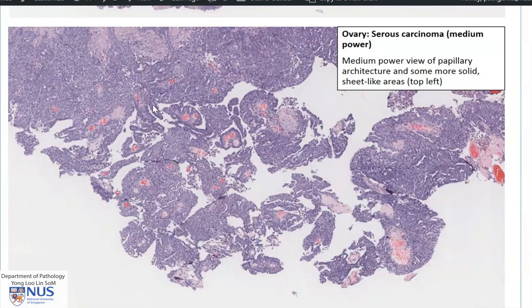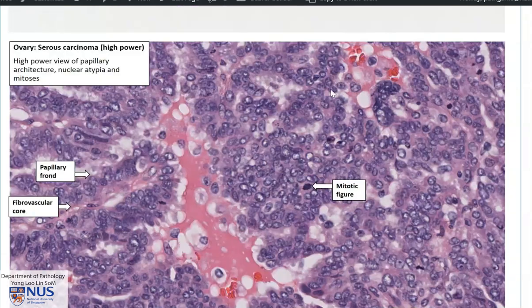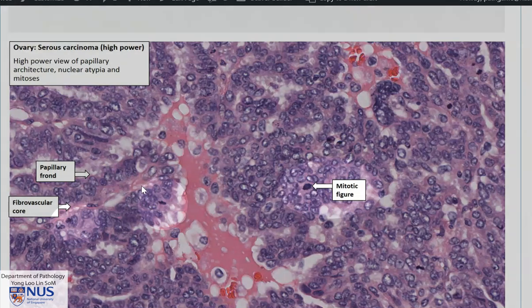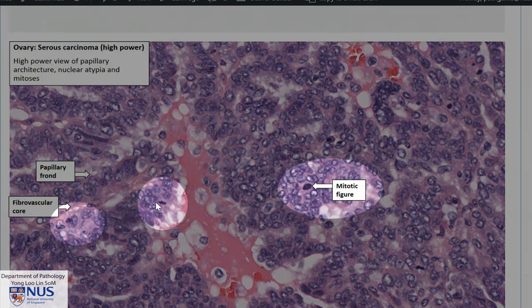At higher magnification, we can see slender but rather complex papillary structures. It is very blue because it is very cellular, and there are large sheets of malignant cells. At even higher magnification, we can see malignant cells forming sheets and papillary structures, with many mitotic figures visible here and here.